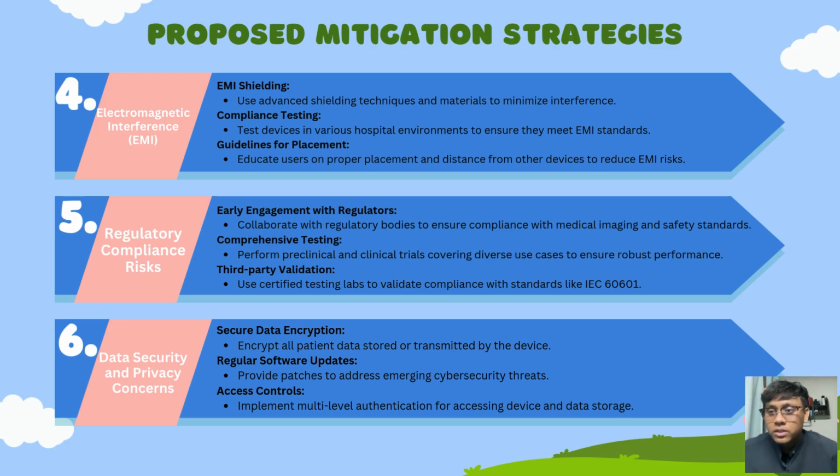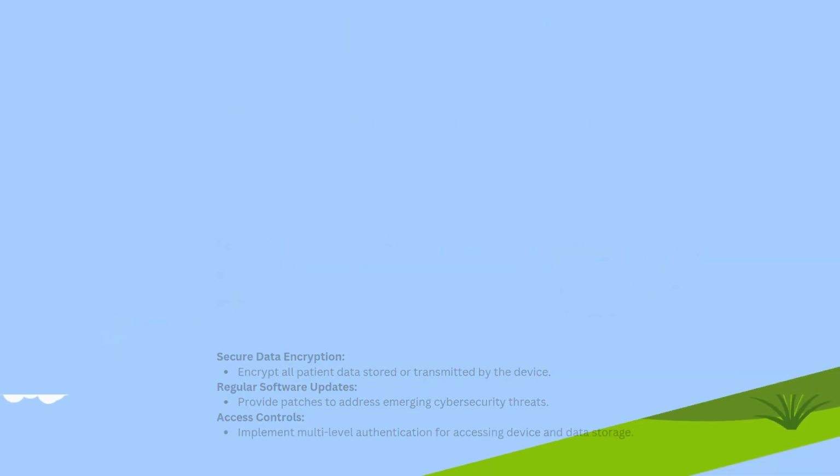For the sixth, data security and privacy concern. Secure data encryption. Encrypt all patient data stored or transmitted by the device. Next, regular software updates. Provide patches to address emerging cybersecurity threats. Last but not least, access control. Implement multi-level authentication for accessing the device and data storage.